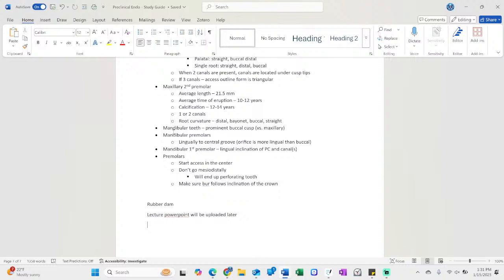It's not like a recipe book where you have to do X, Y, or Z, or step 1, 2, or 3. If you're doing tooth number 7, you can use a premolar clamp to isolate from 5 over. We'll talk about a few different methods for clamping.